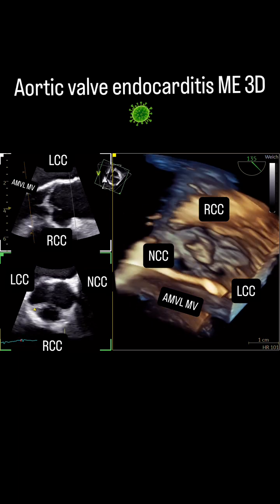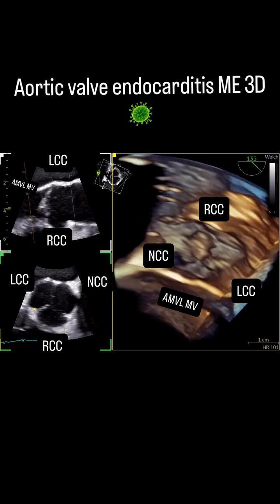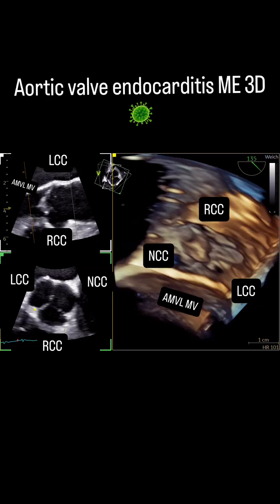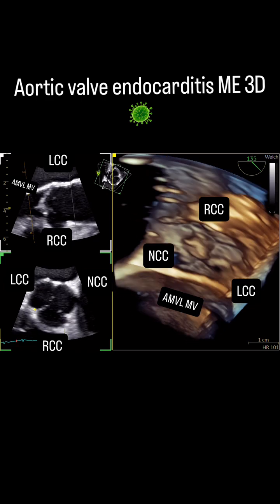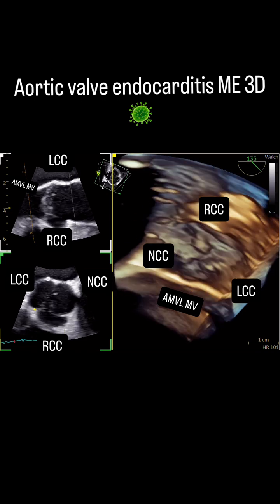If you look closely, you can see the opening and the closure of the aortic valve quite nicely, and that there might already be, as we have identified before, destruction of the valve present.